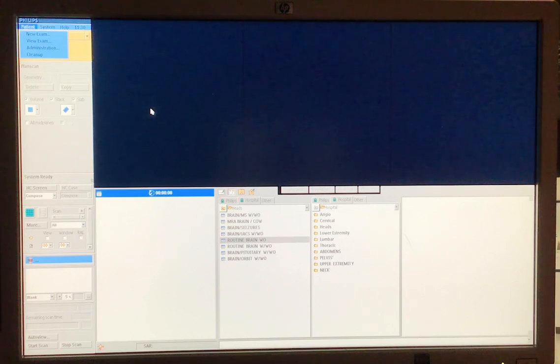You're either going to do a brain with and without for MS, or you're going to do a brain without, okay? So I am going to be following this paper in today's labs. And if there's ever any questions, go ahead and just let me know, okay?